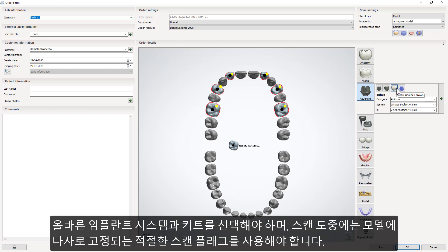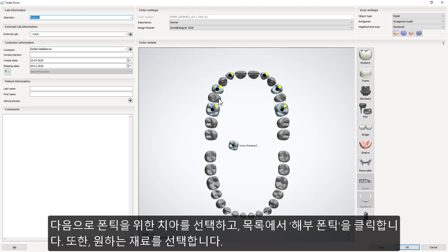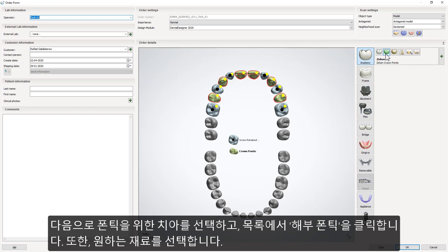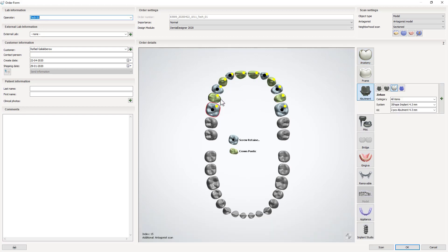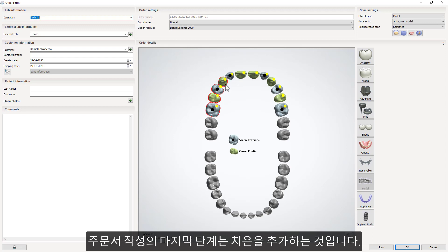While scanning, always use a corresponding scan flag, which must be screwed in to the model. Then choose the teeth for pontics and choose Anatomy Pontic from the indications list. Also remember to select the material of your choice. The last step of the order creation is to add gingiva.